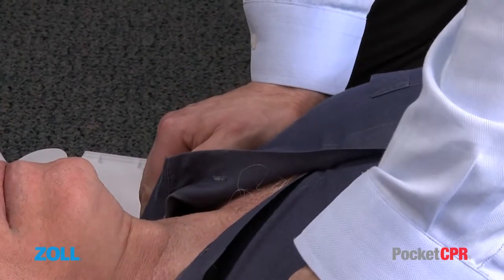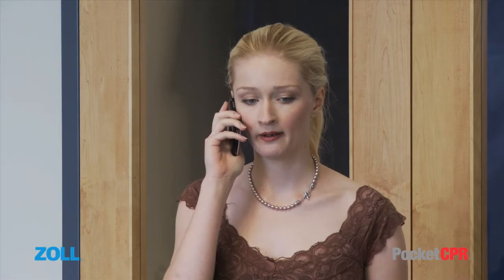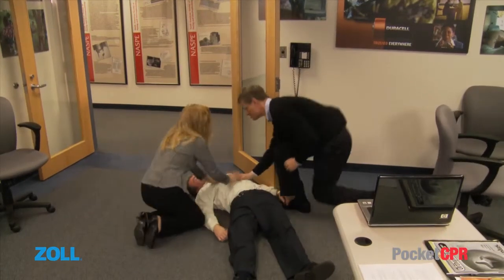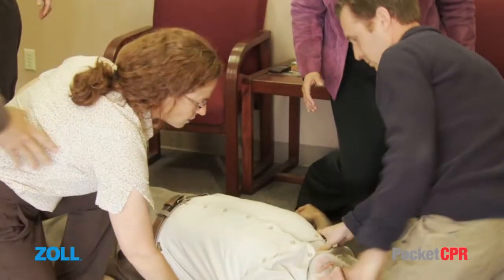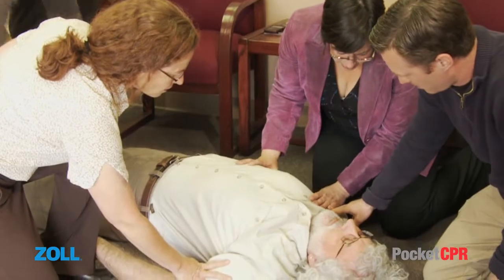Call for help. Call for help to anyone nearby, or call professional help yourself if you're alone. We need emergency help. We're at 17 Main Street. We're on the 2nd floor. While checking for responsiveness, also briefly check to see if the patient is not breathing or not breathing normally. Agonal or gasping breaths are not normal.